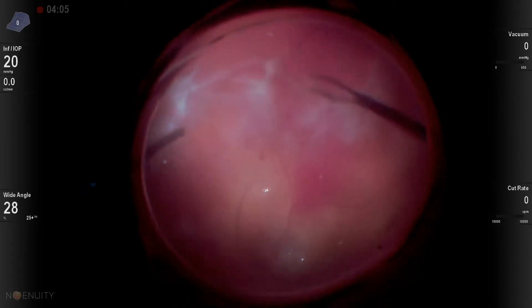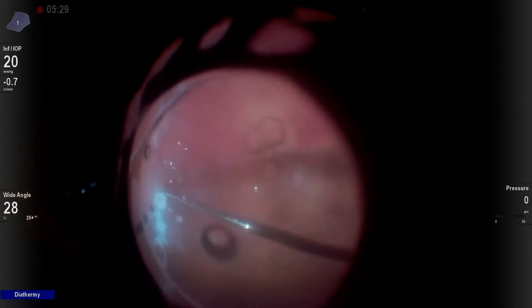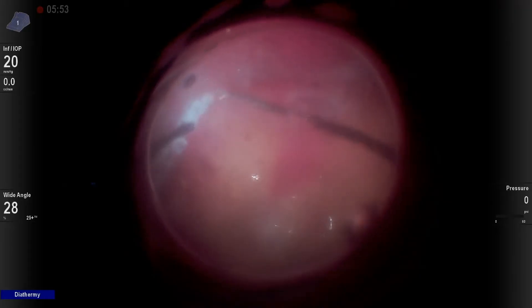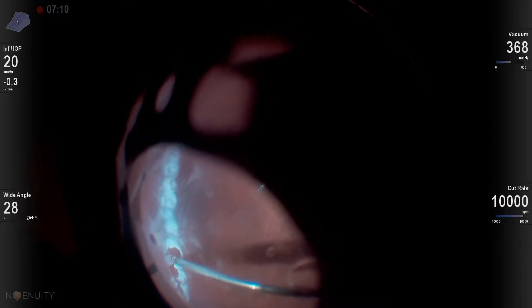We can see here there's some subretinal blood already present. I usually use a two-port approach when I think I'm going to keep the silicone oil in the eye. In this case, I tried to peel the PVR, and unfortunately just really wasn't having luck with it. So very early on, I decided to go to a retinectomy.